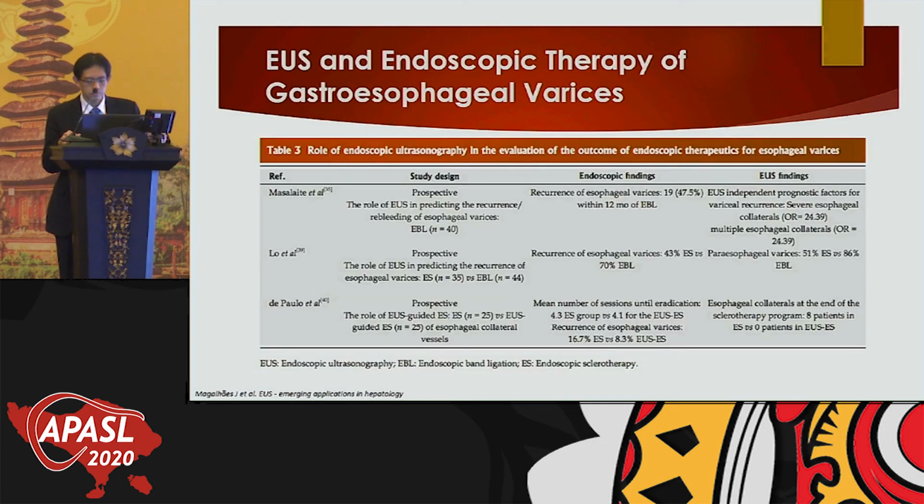So this study shows that even in a still very small number of patients, there is a significant role for the EUS in gastroesophageal varices treatment.